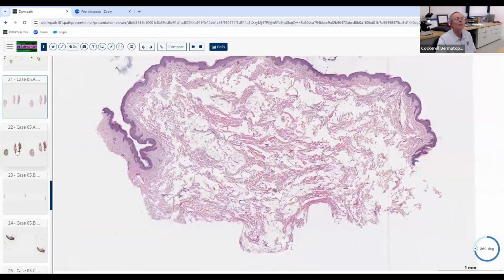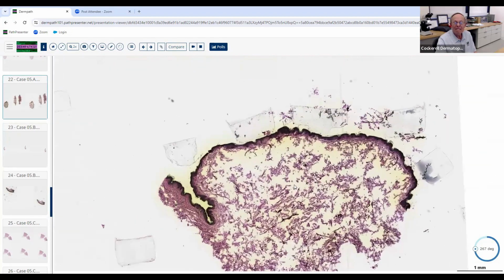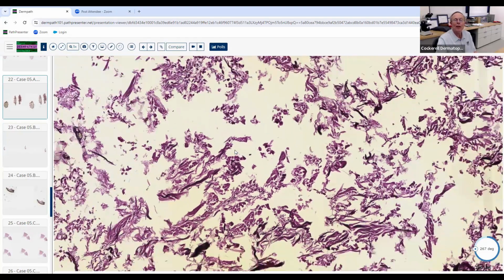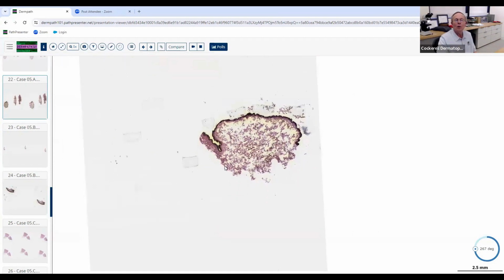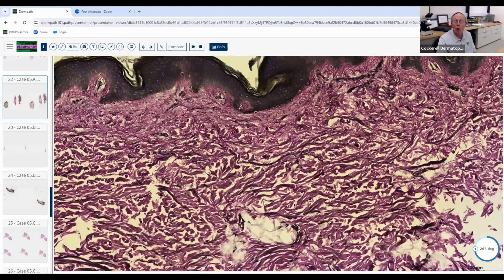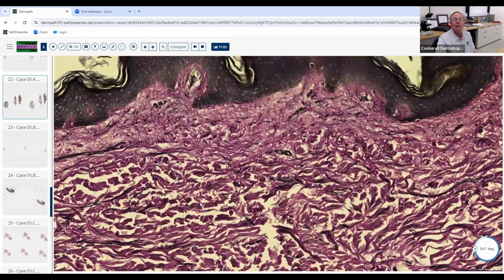And I think we might have an elastic tissue stain in this one also. Yeah, look at this one. This one's got basically no elastic fibers here either. Okay, so basically 0 elastic fibers, subcutaneous fat that's herniated up into the dermis, and the separation of these collagen bundles. I mean, this is a really classic example of an anetoderma. So there's one disease. Here's a piece off to the side. Notice, see, there's 0 elastic fibers here. It's even better than the one before. There's none here. So in a fully developed anetoderma-like lesion, no elastic fibers, totally atrophic skin.